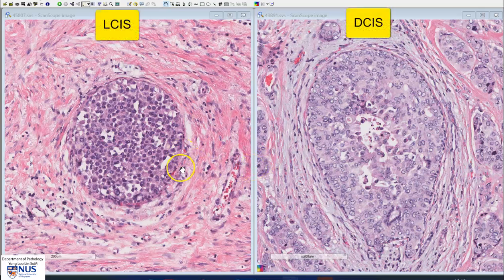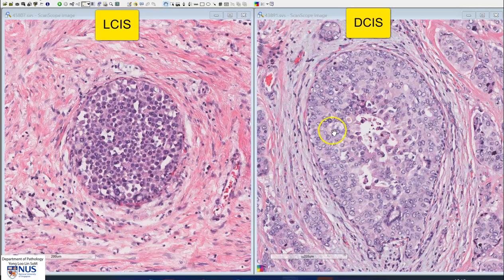Here is a comparison of LCIS on the left and DCIS on the right, shown at the same magnification. You can see that in DCIS, the cells are more pleomorphic, with more variation in nuclear size and shape, and they are also larger. This particular case does not show a cribriform architecture, but cribriform architecture is common in DCIS and generally not seen in LCIS.